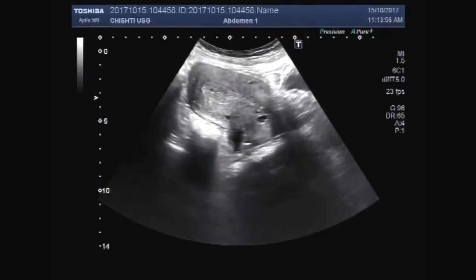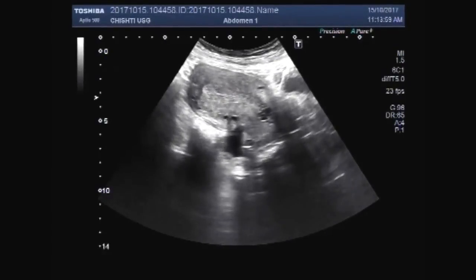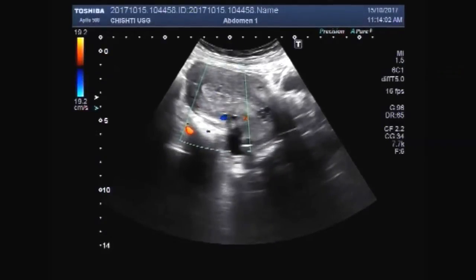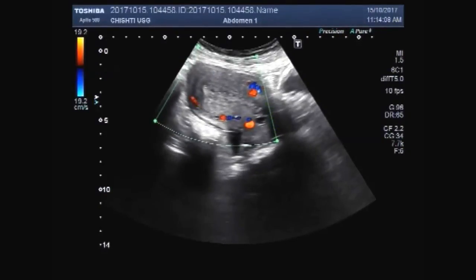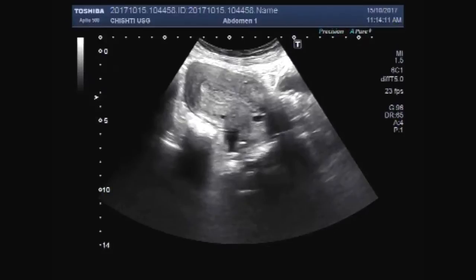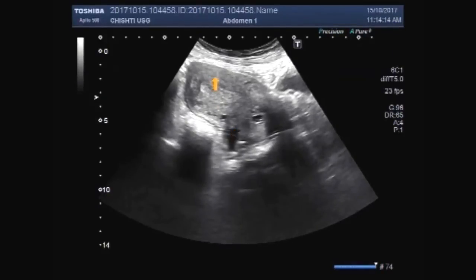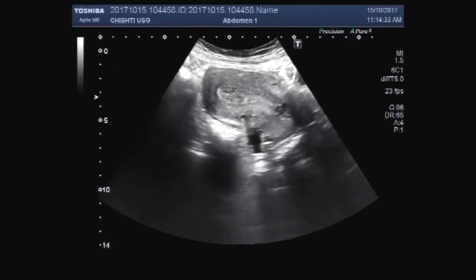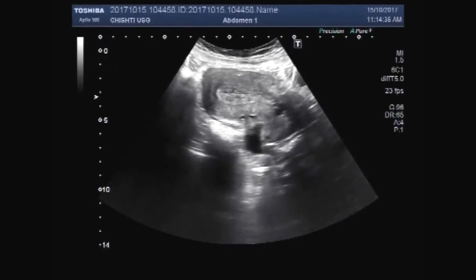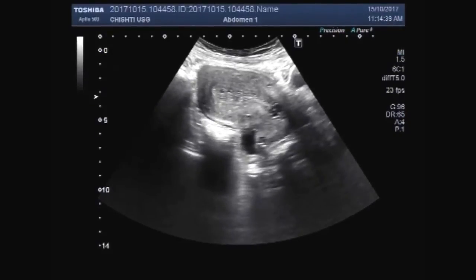This is the fluid in the cul-de-sac. Now in the distal portion of the uterine cavity you can see a polyp — a polyp in the uterine cavity. To summarize so far: cervical cyst, inflammatory fluid in the cul-de-sac, and uterine polyps.